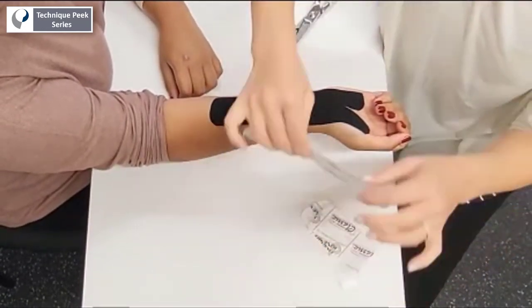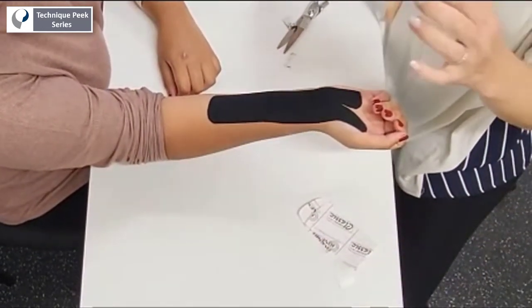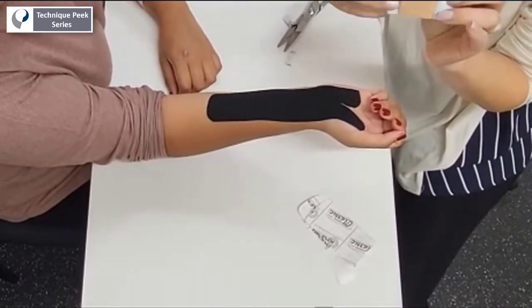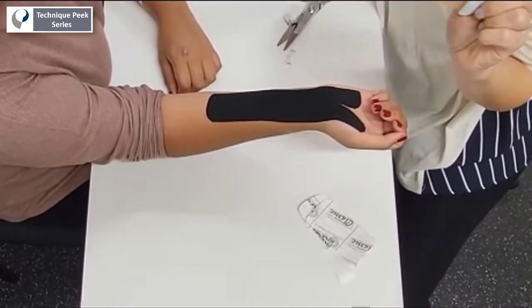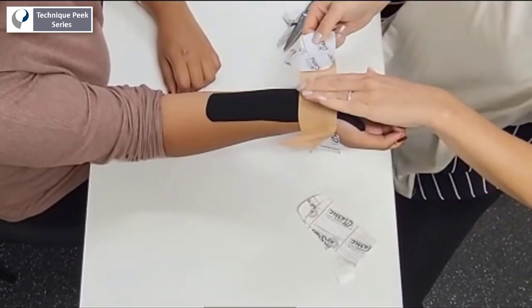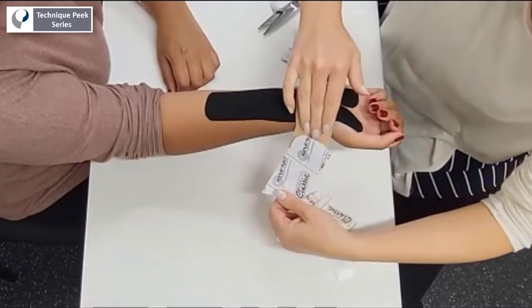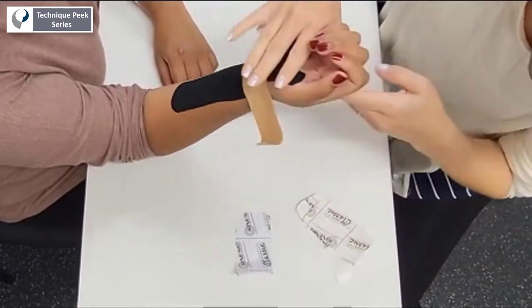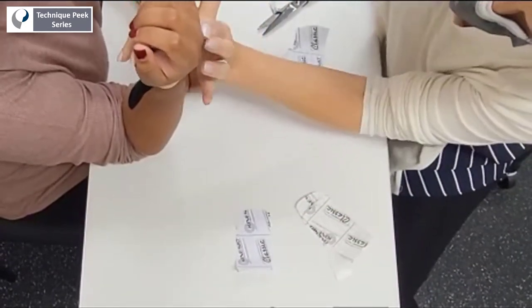For the wrist piece, tear it in the center, peel back the edges and pull 100% tension and reduce by 50%. With 50% tension, apply over the carpal tunnel and allow the ends to recoil, applying circumferentially around the back of the wrist with zero tension.